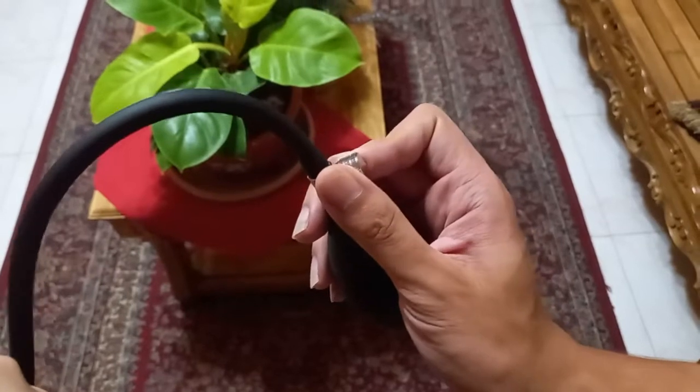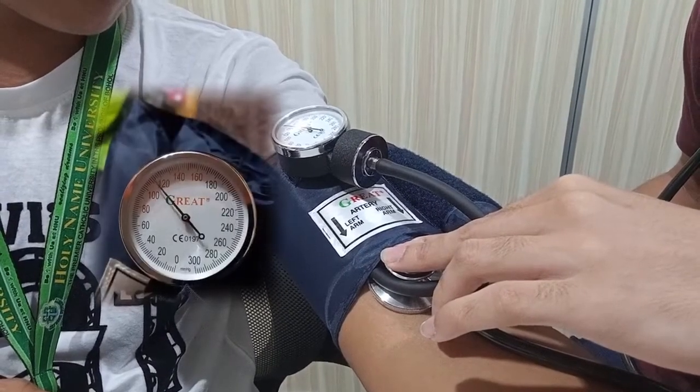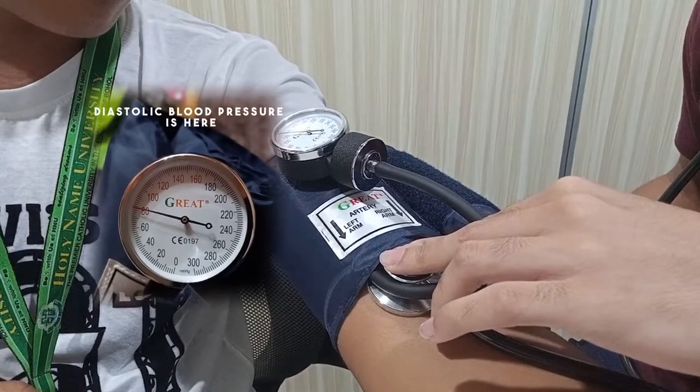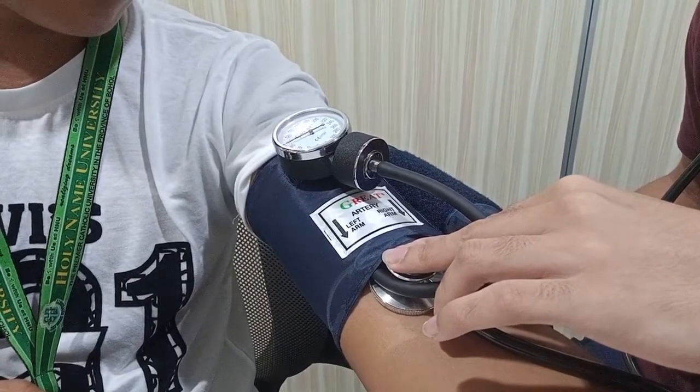Seventh, continue to slowly deflate the cuff. Eighth, listen carefully until the sound disappears. As soon as you can no longer hear your pulse, note the reading on the gauge. This reading is your diastolic pressure, the blood pressure between heartbeats.